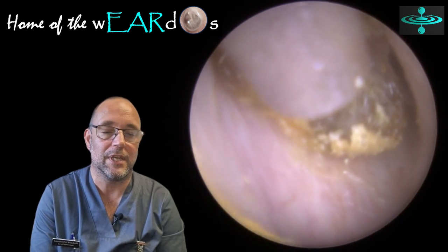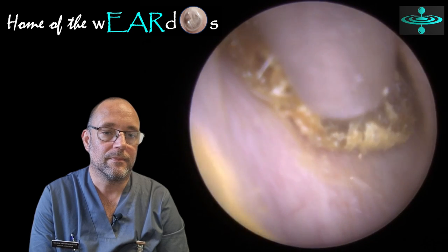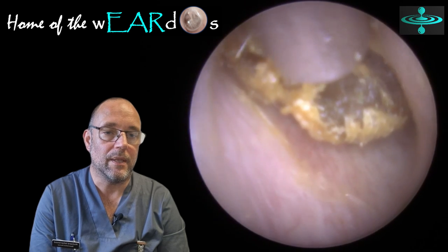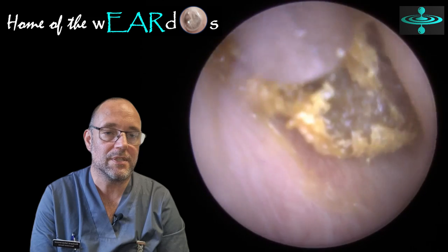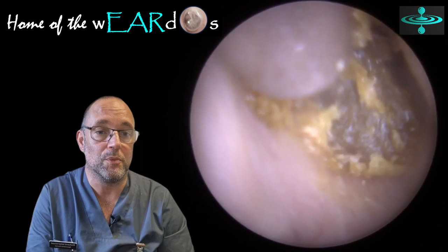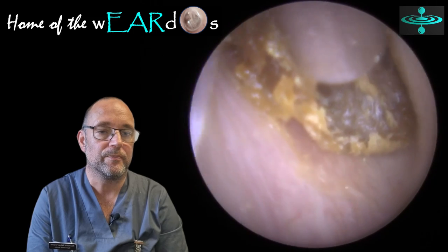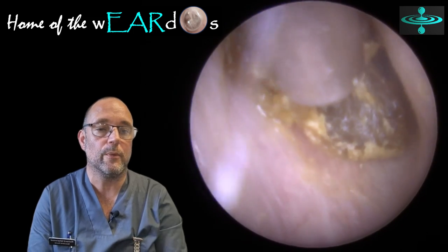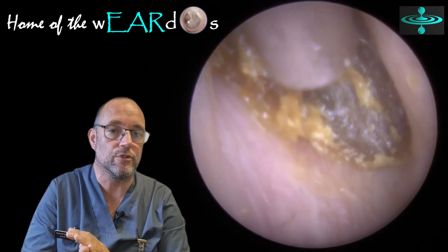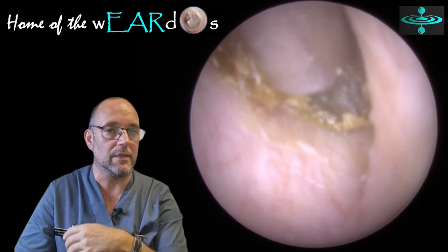You can see it's getting darker and darker as some of that newer section starts coming away. I've got a grip and I'm trying to move it side to side. There isn't really much room to wiggle around, so you've got to do really tiny movements to try and wiggle this free. What you're also waiting for is to get that perfect seal — you want to block the suction tube up. As soon as you block it up, the power in the machine goes up and then you can start pulling it away.